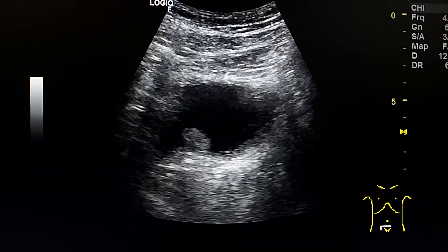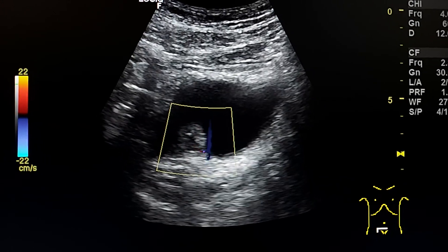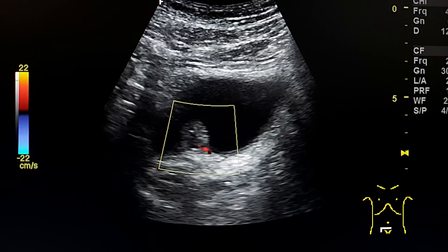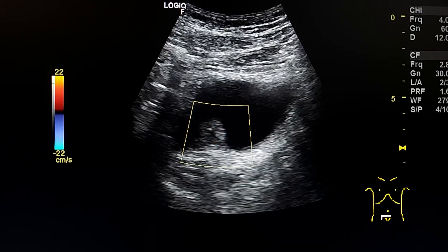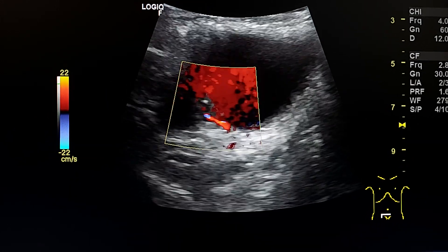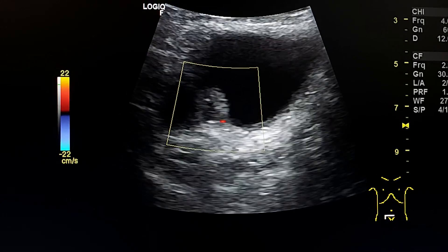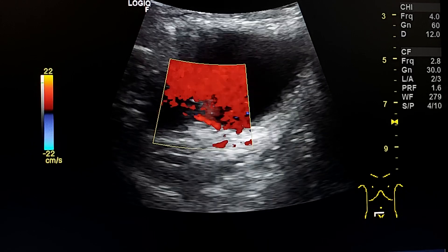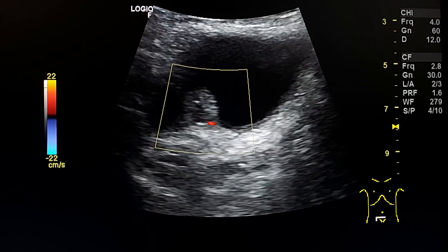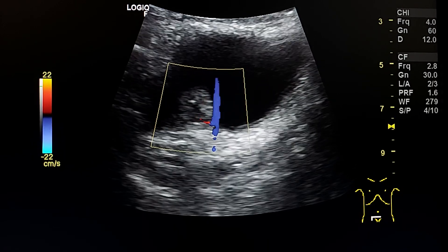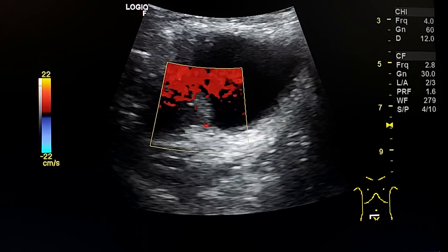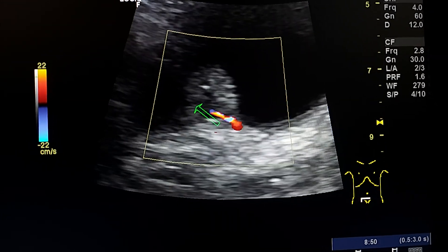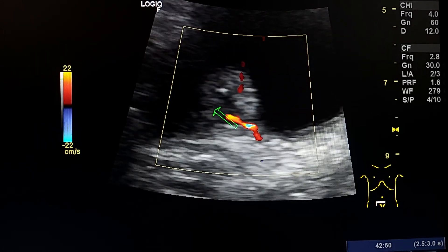By using color Doppler we can differentiate. Here we see a central artery in the lesion. This means that it is a neoplastic lesion arising from the mucosa of the urinary bladder, likely a TCC. We can also see a central hypoechoic area in the lesion.